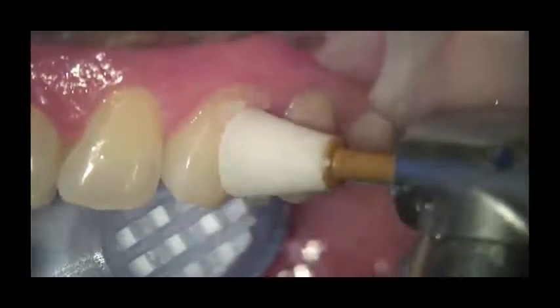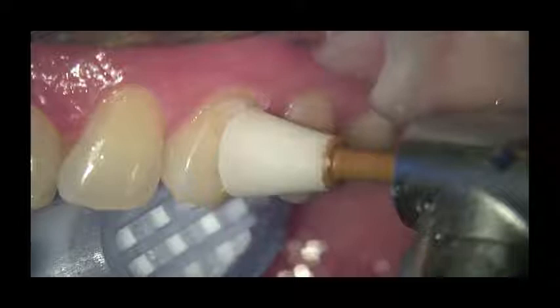And then I'll use the Dentsply's Enhanced Cups. I've used this product for many, many years, either the cups or the points, and the cups work really well for Class 5 defects. So I use a variety of products to get a good shape and finish to my restorations.